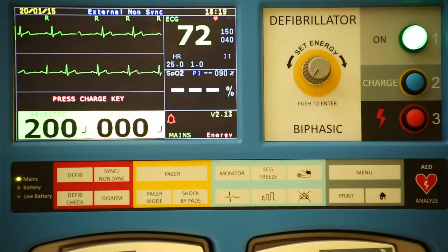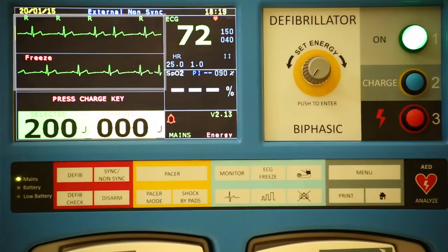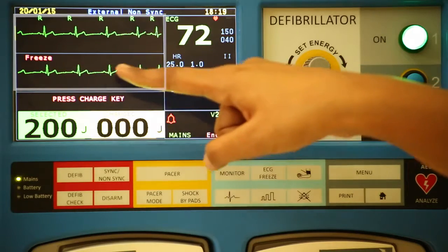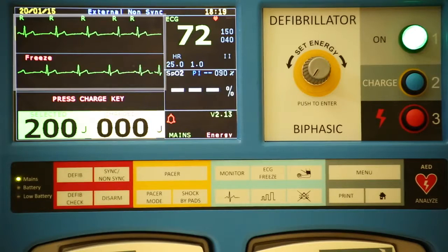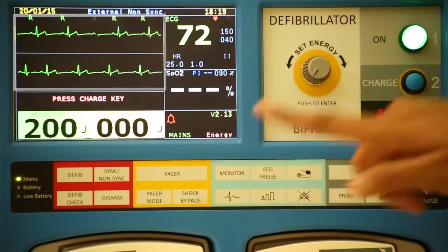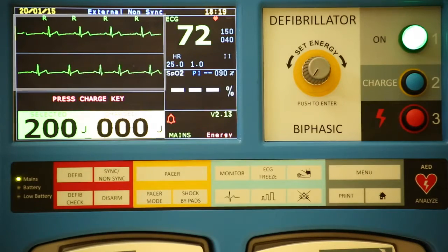Press ECG freeze key to freeze last 4 seconds ECG. The upper part will show online ECG and lower section will show frozen waveform of ECG. That is a 4-second delayed waveform. To unfreeze the waveform, press ECG freeze key again. The screen will start showing ECG delayed by 4 seconds as that of the above.